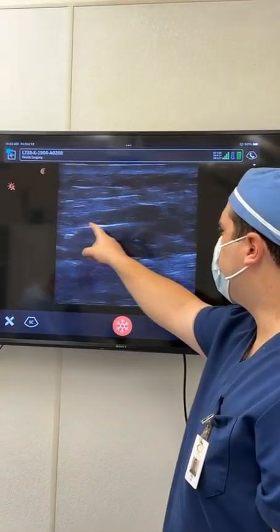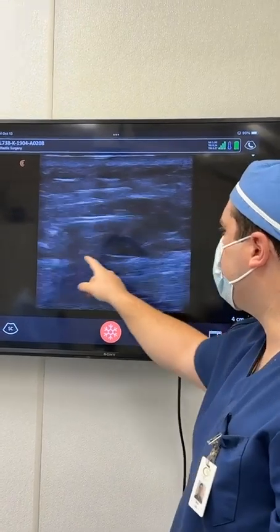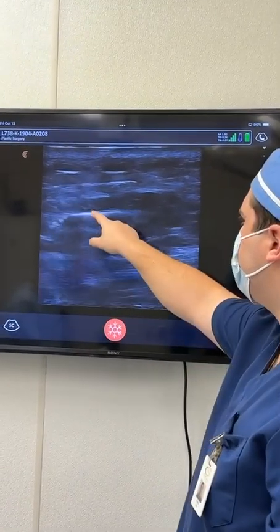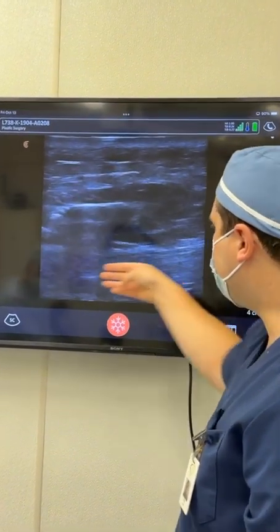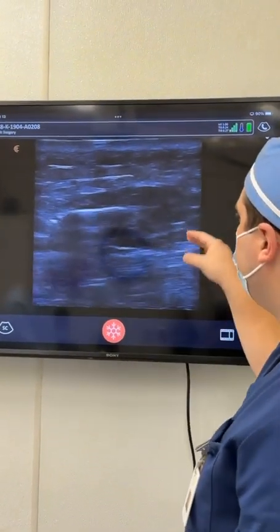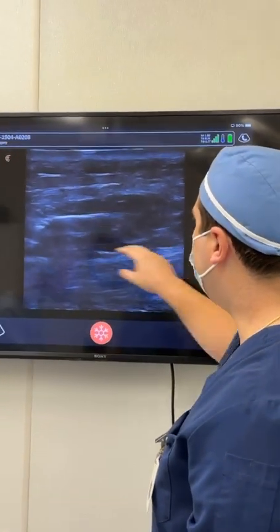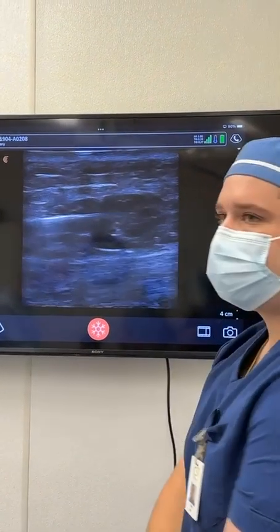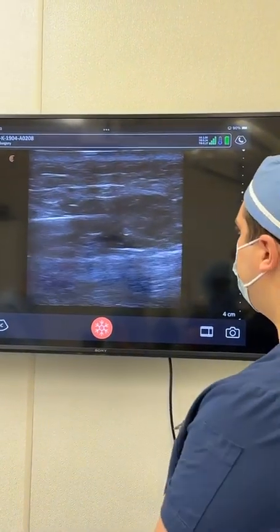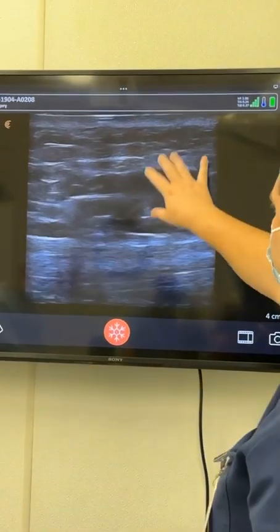Alright, so we're doing ultrasound guided gluteal fat transfer. This is Dr. Patino's cannula right here. It's the bright line that's in the middle. This is the deep gluteal fascia. I'm wiggling it so you can see it move. This is the muscle. You can actually see the striated muscle. This is where we don't want to be putting any fat, which is why the doctor's right here above it. This is the superficial gluteal fascia, and that's the patient's skin.